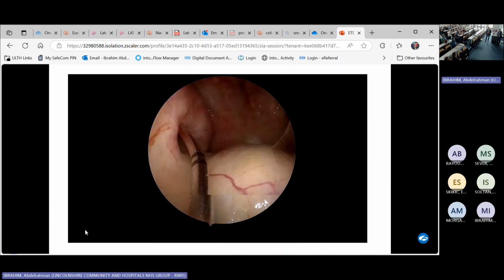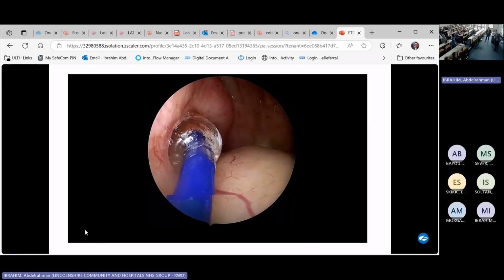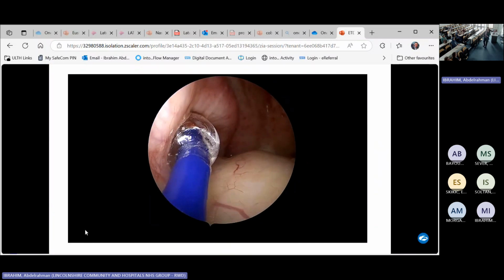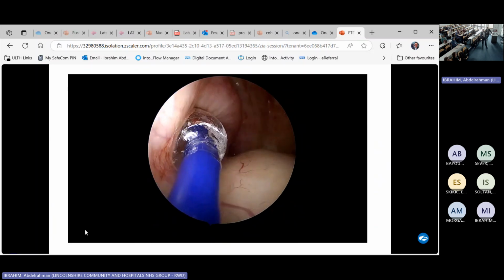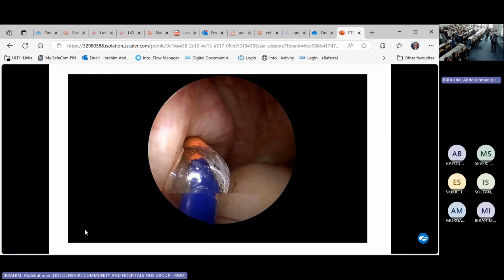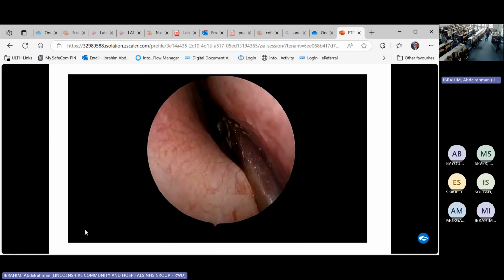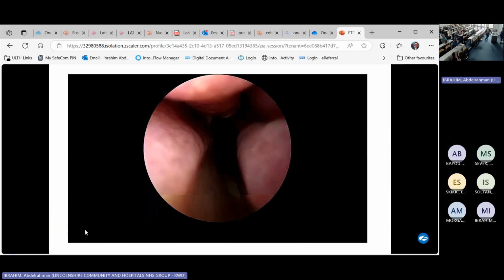So I slide this easily. There is no resistance. Then I inflate the balloon and wait 2 minutes. We say silly jokes. It's the longest 2 minutes until the balloon starts working. It seems simple, but it's not. Then after 2 minutes, I deflate, I come out, and here is how it looks. There will be 2 to 3 drops of blood. Don't panic. We didn't go into a false pathway. It's very, very important.